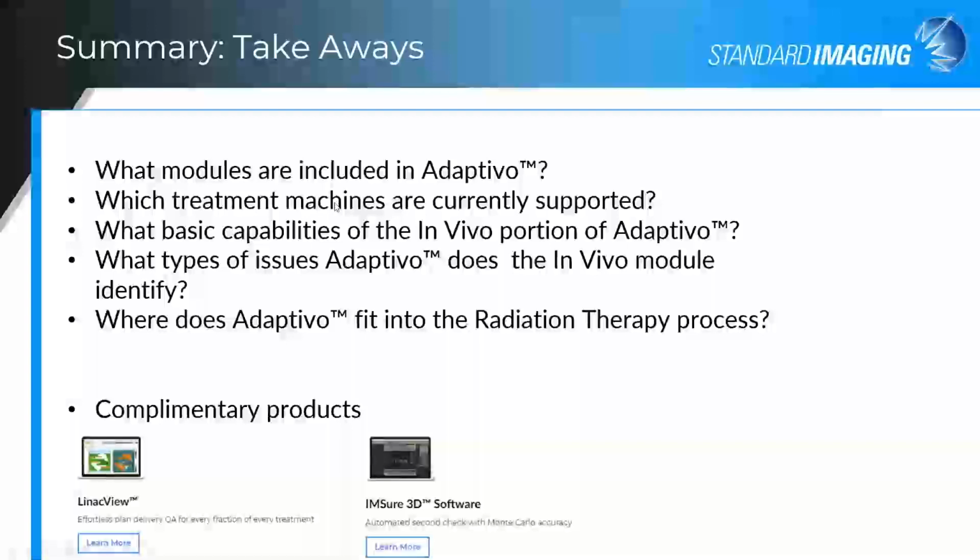It's going to alert you to those path length changes. So the beam's going to traverse, or it's transit dosimetry of the patient. When that beam passes through, based on your reference or the treatment plan, it's going to alert you when there's a change. And then your ancillary investigation is going to help you go investigate whether there's something there that you need to particularly take action on or not.